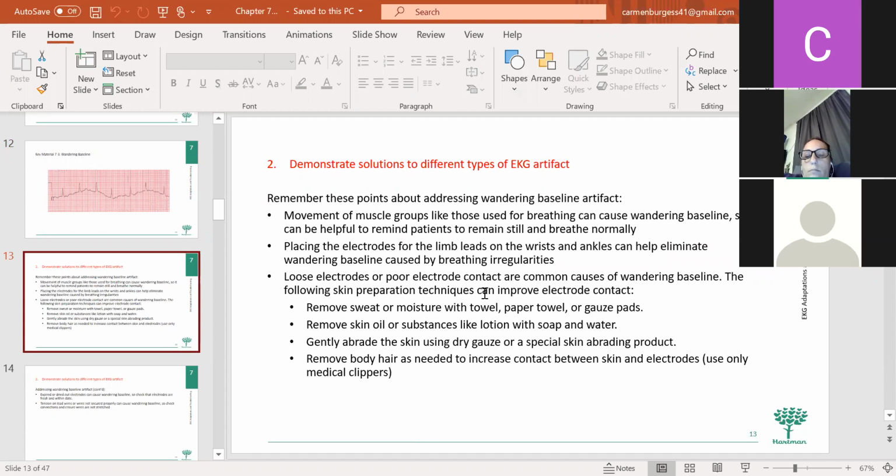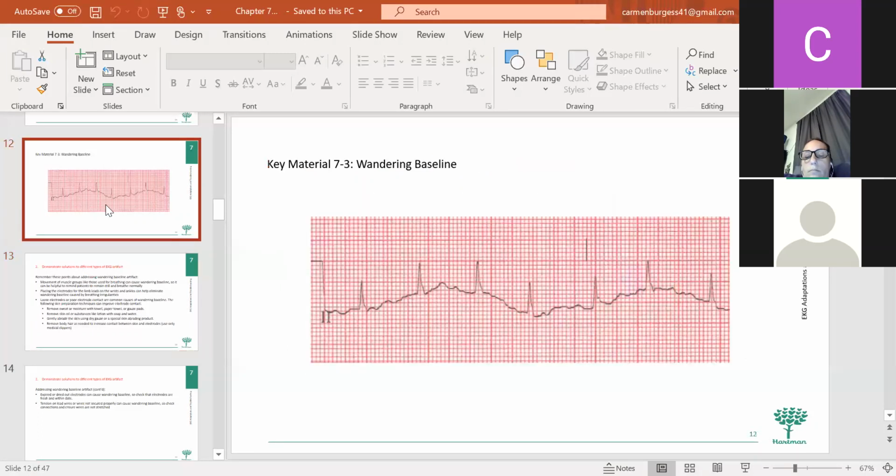Like, you ever seen somebody walk through the mall and they're just not really sure what they're doing? They're kind of all over the place, but somebody who's definitely getting to that Black Friday sale is going straight. They're not wandering anywhere. So you have to think, what's causing this? The electrode is not secure. It's moving around.